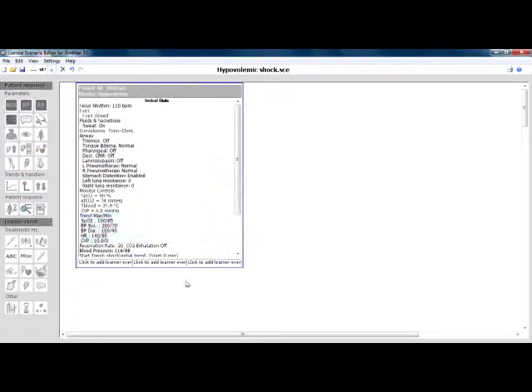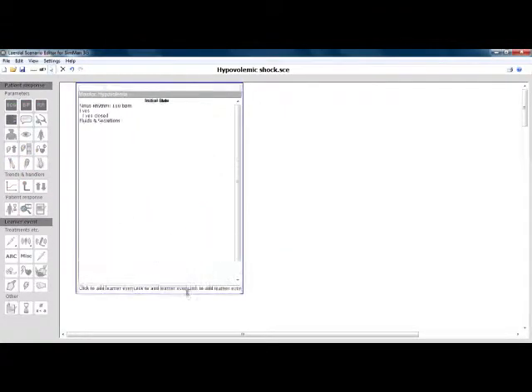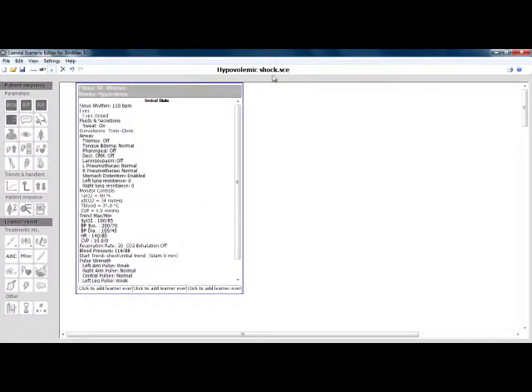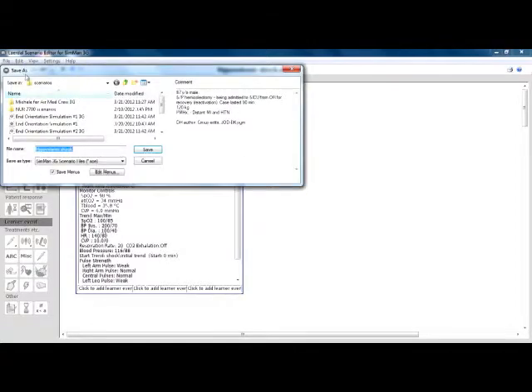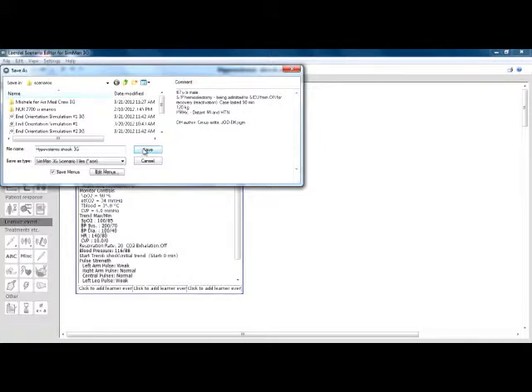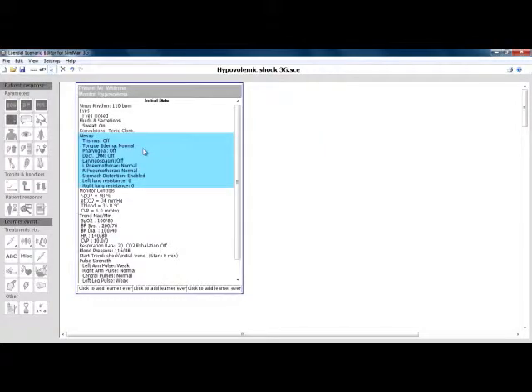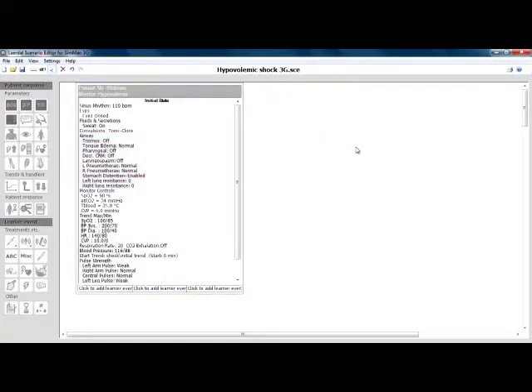Once you are satisfied with the new scenario and you have checked to make sure that it has converted properly, you will now need to resave the scenario. These scenarios will also be .sce files, so it is a good idea to label the scenario as a 3G or essential scenario so it doesn't get confused with the previous version. I usually just add 3G or ESS on the end of the name.